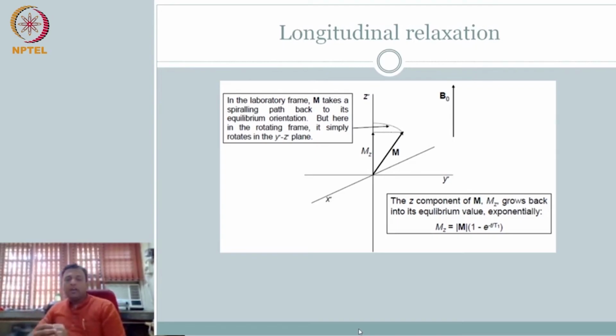Now you recall we talked about, of course, you have to apply an excitation pulse. I mean, you have to have an additional excitation pulse. That's a given. So now the question is, how will you apply the excitation pulse, when the spins are already on the floor, right? What are you going to do? If I apply another 90-degree pulse, it will go down. No transverse component. So it doesn't make sense. Right? So what will I do?